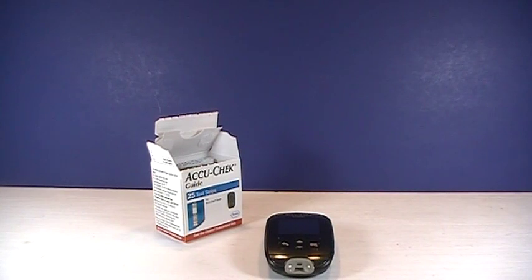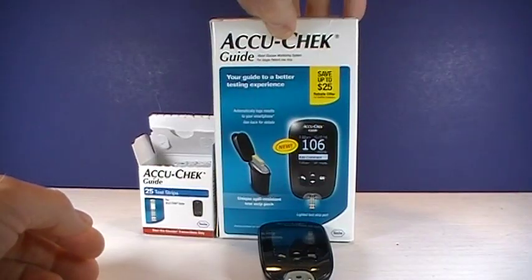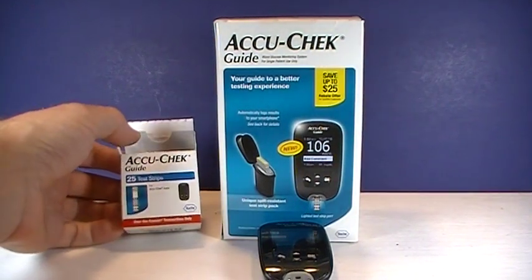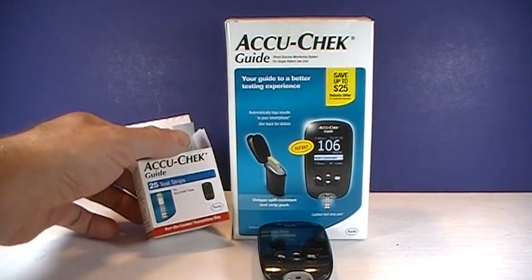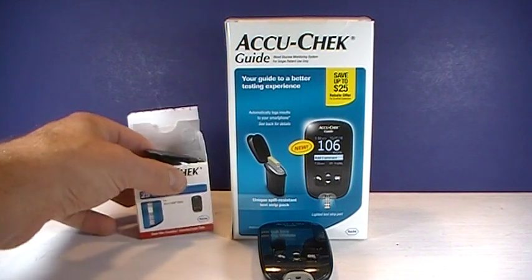Hi, Josh with PharmacistTips.com with a real quick video on the AccuCheck Guide meter. This meter runs about $32. Test strips vary — the 25-count I paid about $18 for. Many insurances cover the AccuCheck, so if you have health care insurance in the U.S., the insurance may pay for a portion of that.